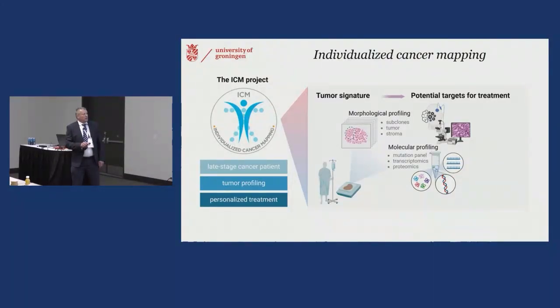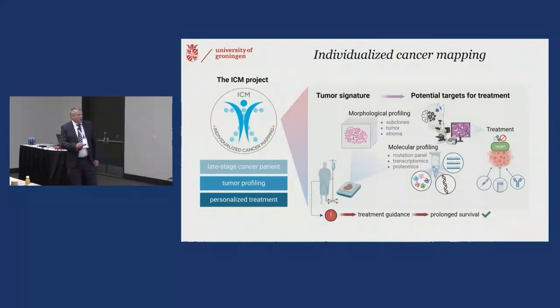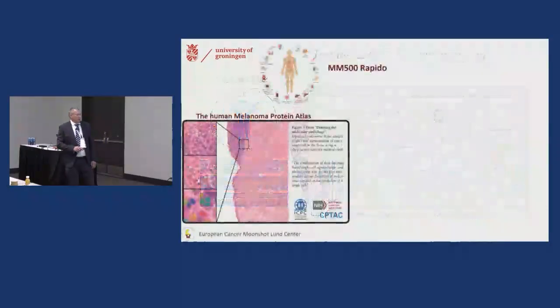Then from an adjacent slice, or from the same slide used for digital pathology, we generate the multi-omics profile. Currently it is per slice, but we are also working on laser microdissected workflows where we go into a different part of the tissue and don't analyze the full tissue as one. We use the obtained data to find biomarkers or up and down regulated pathways which we can drug target and suggest new treatment for prolonged survival.